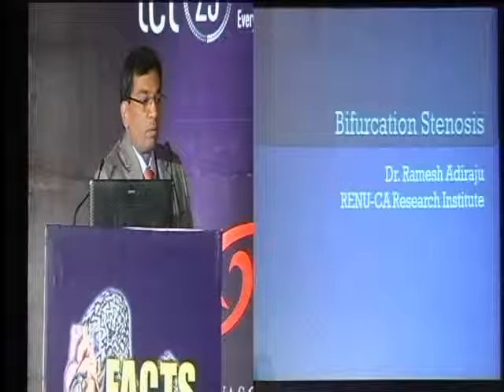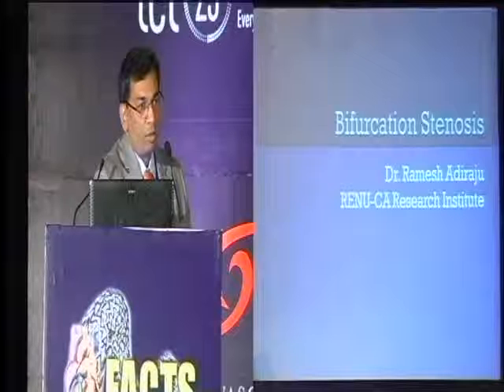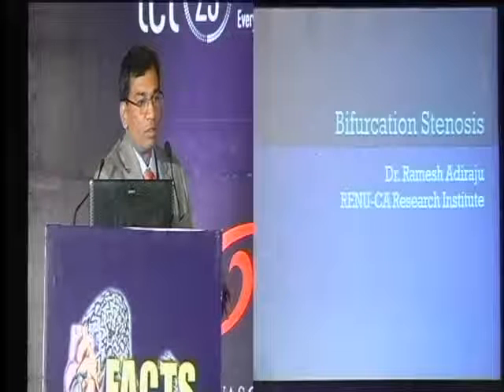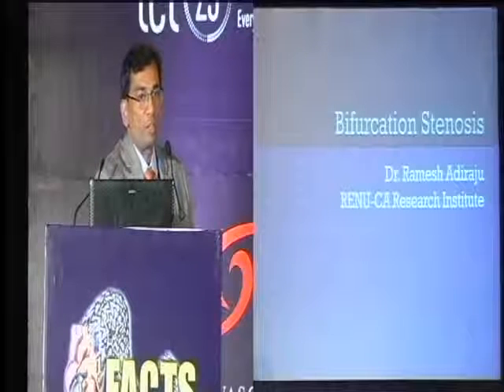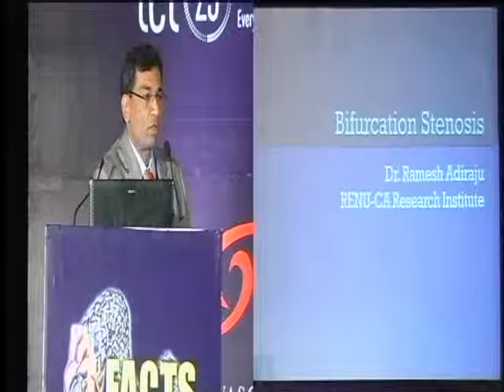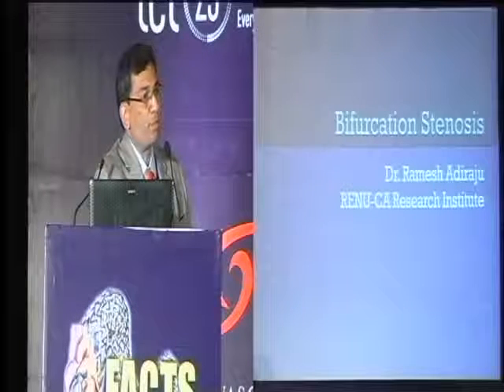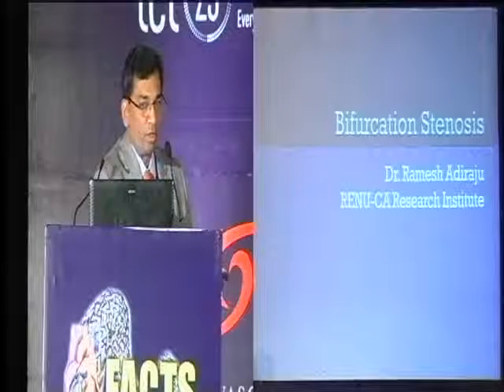So in bifurcation stenosis, particularly major bifurcation, I'll just go over what I mean by major bifurcation stenosis. I've utilized directional atherectomy to debulk the lesion, so if you need to, you can minimize stenting by just putting one stent on the main vessel, or sometimes the branch vessel if it is a big vessel. This is the topic that I was invited by Dr. Colombo to present at the GISE meetings this year. So I'm going to use that presentation to explain atherectomy in general.